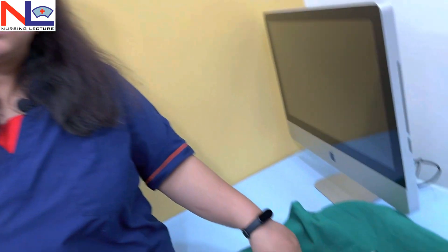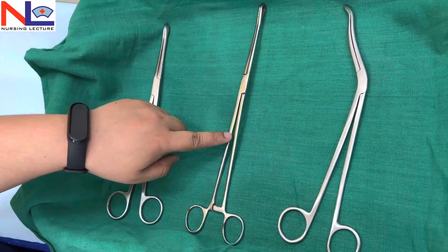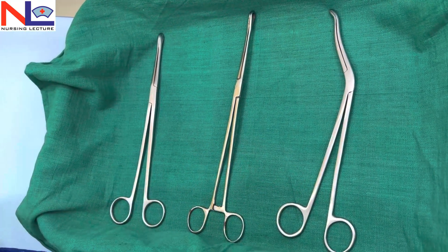In this lecture we have discussed three important instruments: the ovum forcep, sponge holding forcep, and the chiddle forcep. In the next part 3 we will discuss other instruments. Thank you.